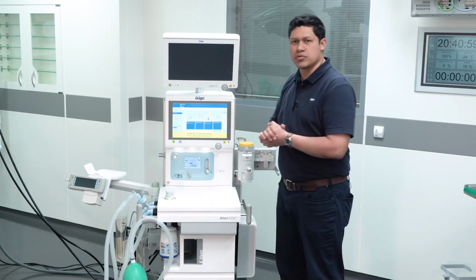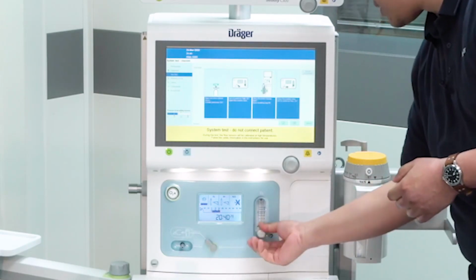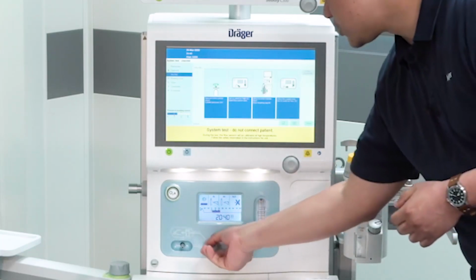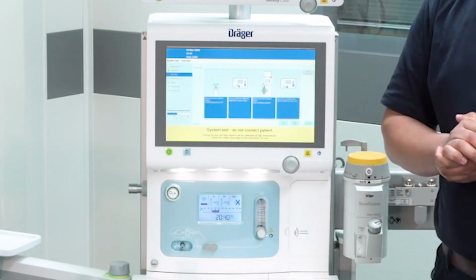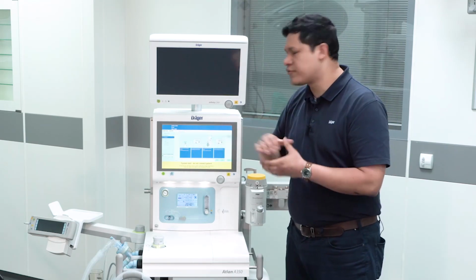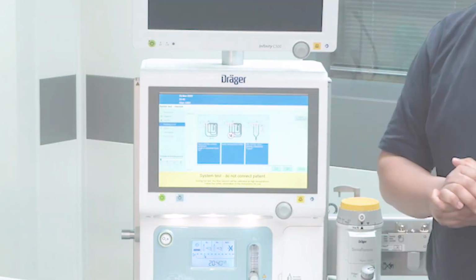Finally, you close the oxygen control valve and you put back the switch on the auxiliary oxygen position. Once you have finalized verifying the gas flow group of tests, you press the check sign.